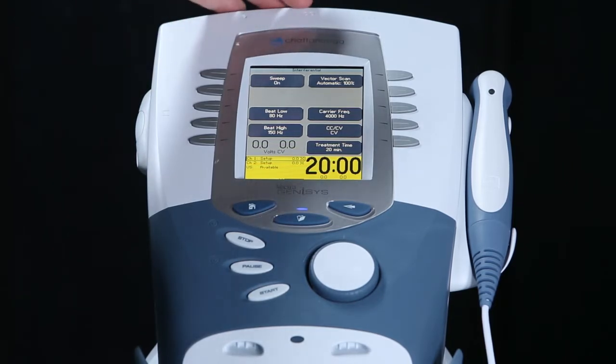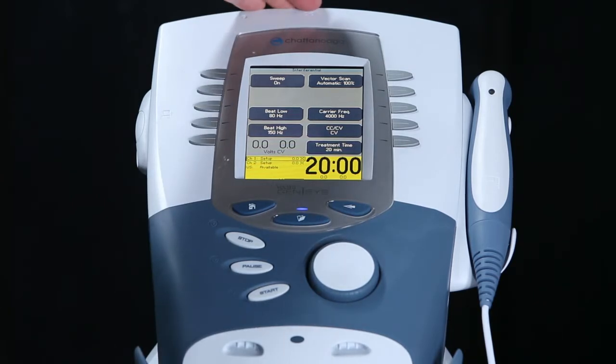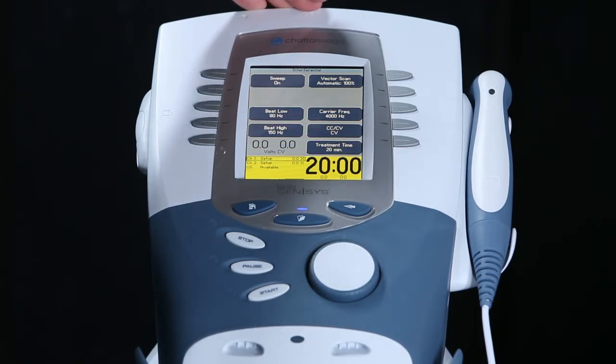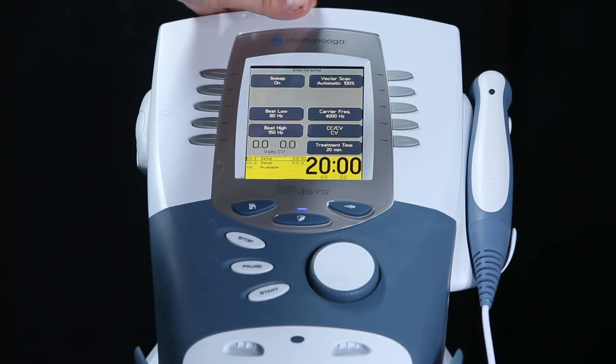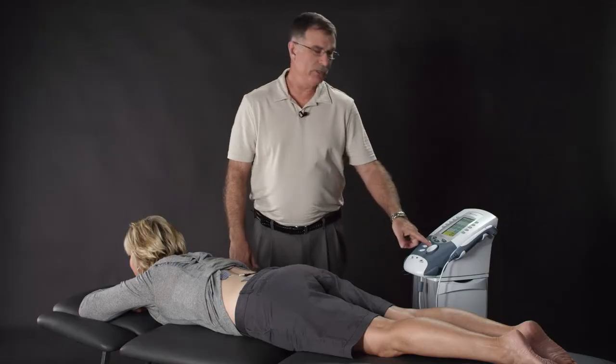The next parameter then is constant current versus constant voltage. Since we're using a continuous duty cycle, what we want to do is keep this on constant voltage. Again, for comfort of our patient. The last adjustable parameter is treatment time, and treatment time typically for a gate theory protocol will be around 20 minutes. Now let's turn up the amplitude.